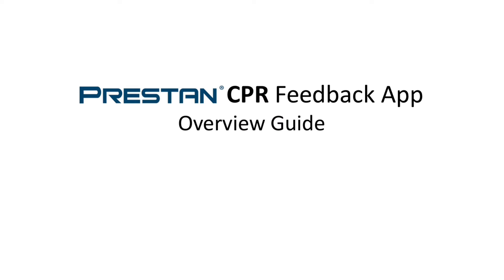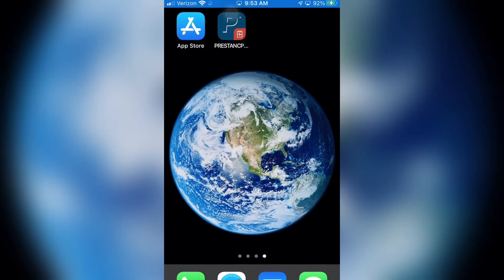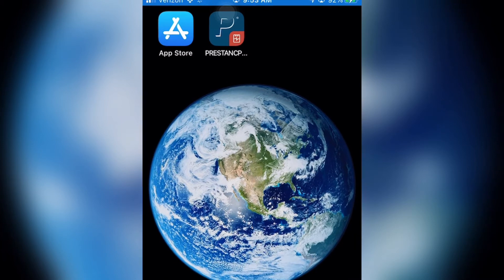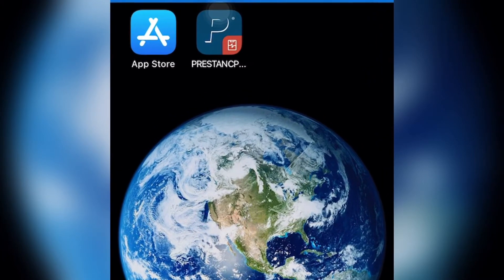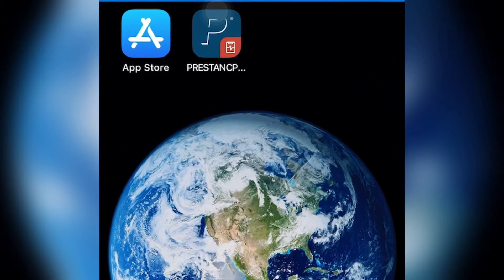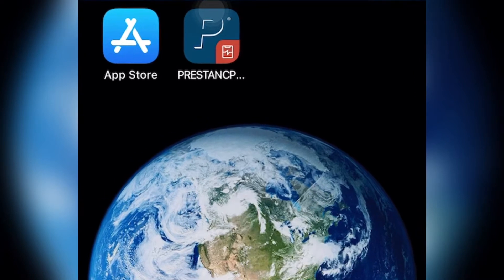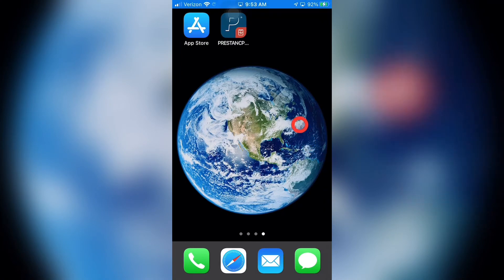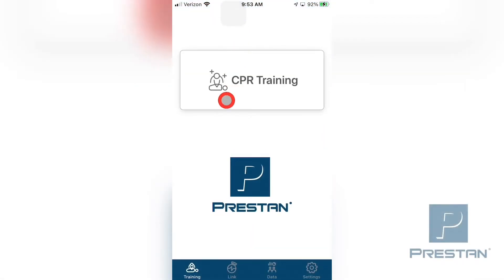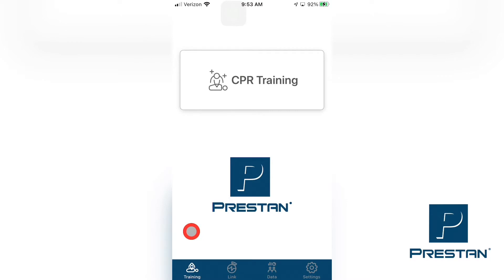PRESTAN CPR Feedback App is for instrumented directive feedback devices that meet the requirements of the latest American Heart Association and Heart and Stroke Foundation of Canada CPR Feedback Guidelines. The PRESTAN CPR Feedback App contains a number of tabs at the bottom of the screen that can be used to manage and control the device and the data.